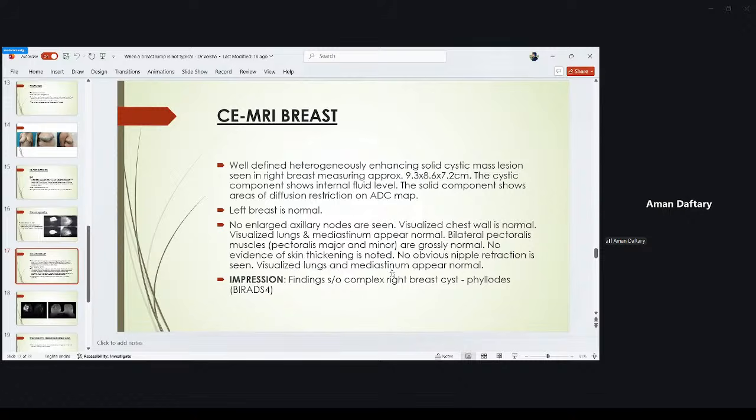In a phylloid tumor, you see multiple cystic spaces of unequal sizes on ultrasound, or you see calcifications and a lot of heterogeneity of the mass. When we see that, we raise the possibility of a phylloid tumor. This tumor increased in size very rapidly, so clinically you were also thinking of that. But there are many times where you may not think of it clinically as a phylloid tumor, but it comes back as one, and the imaging findings are pretty classical on ultrasound.